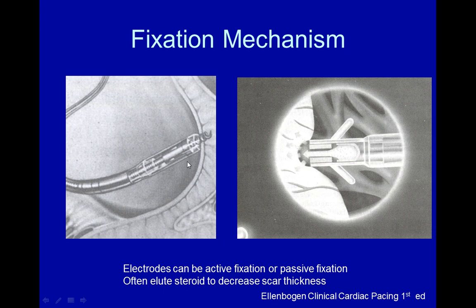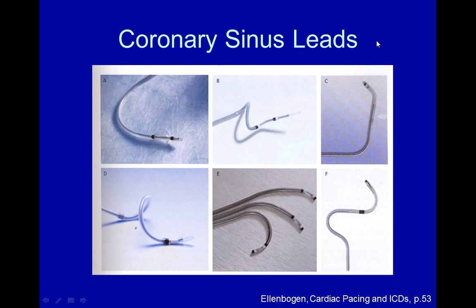Now, if you look at a pictorial image of what it would look like in the heart, here you can see an active fixation lead and a passive fixation lead.